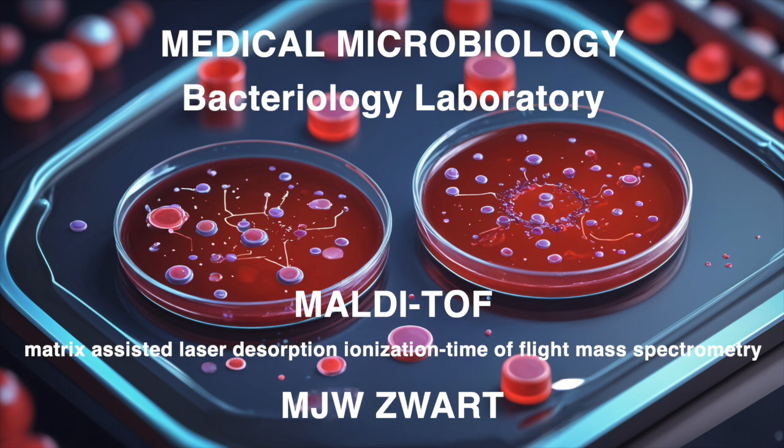It's like making sure our high-tech microbial detective is ready to solve the case. Ready to get to work. The document really emphasizes this distinction between validation and calibration. Can you break that down for us? Right. Think of validation as your daily checkup. Just a routine thing to confirm that the Microflex is working right, producing good results.